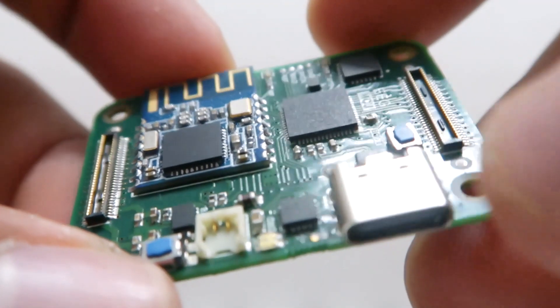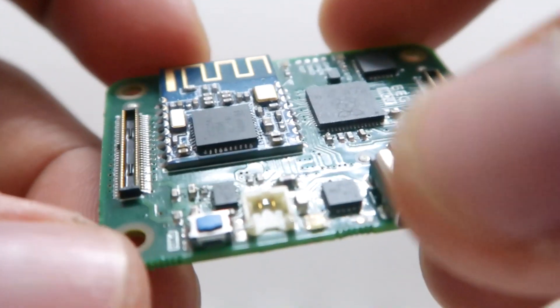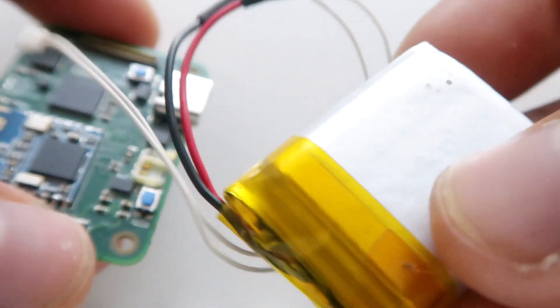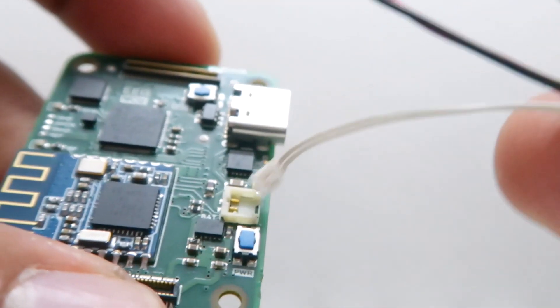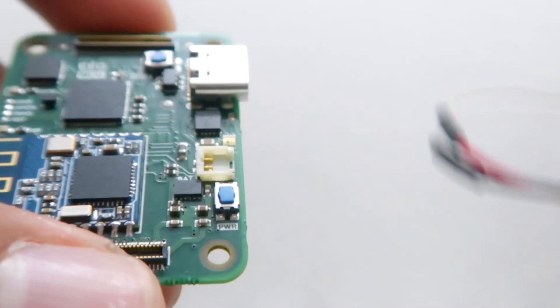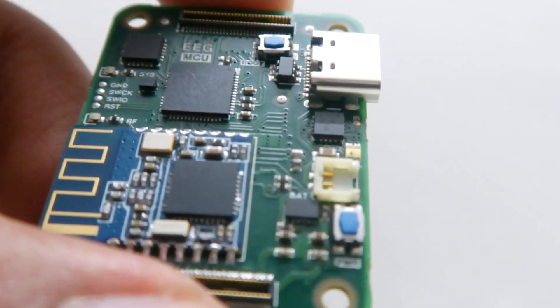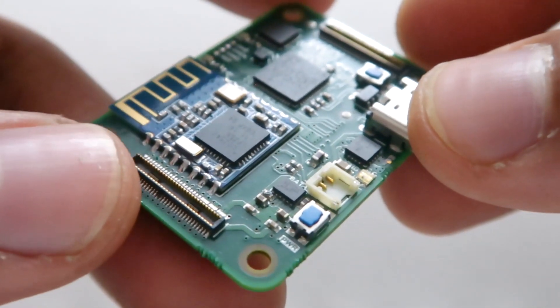It has a USB-C port for communication with the RP2040 and for battery charging. It accepts a 1S lithium battery with a JST ACH type connector, and it has all the necessary battery management and charging features, along with the necessary LDOs for different voltage levels.